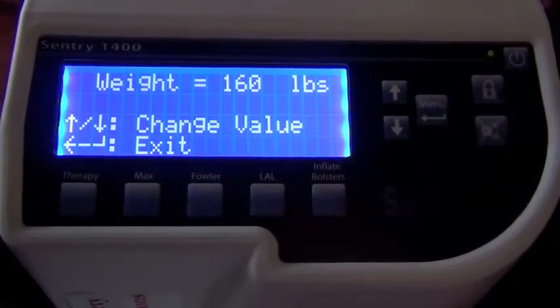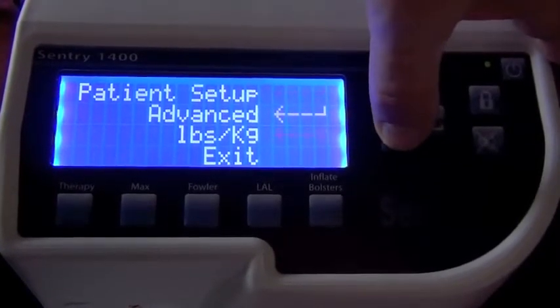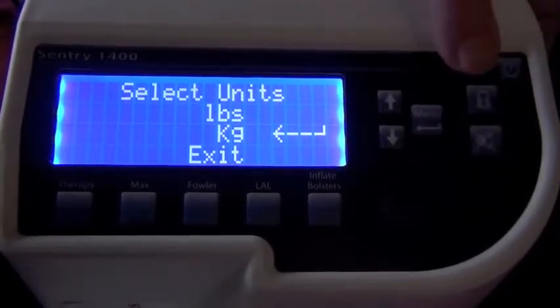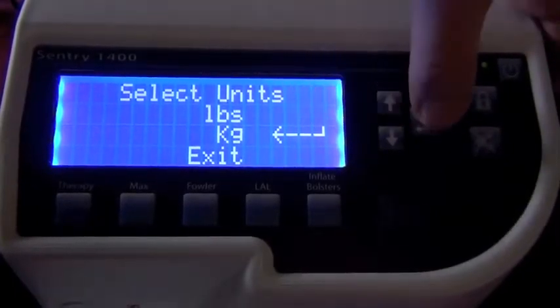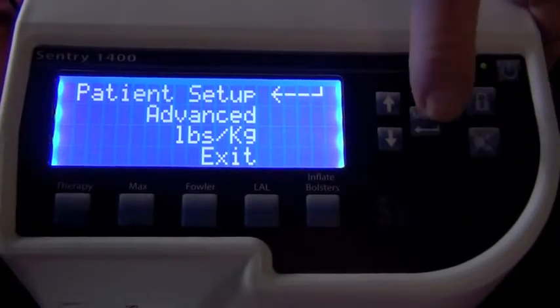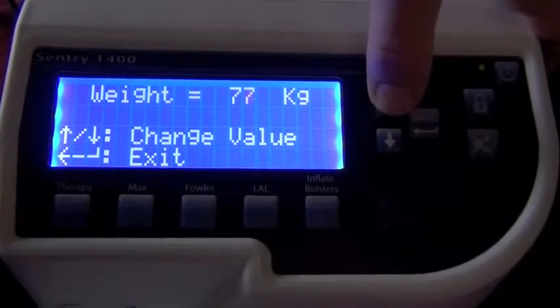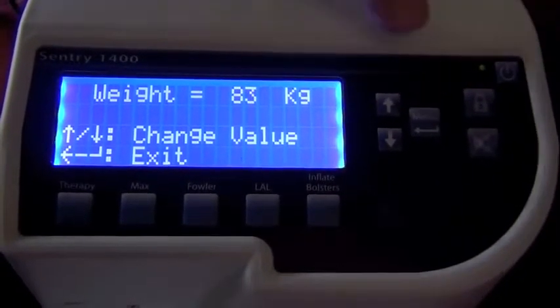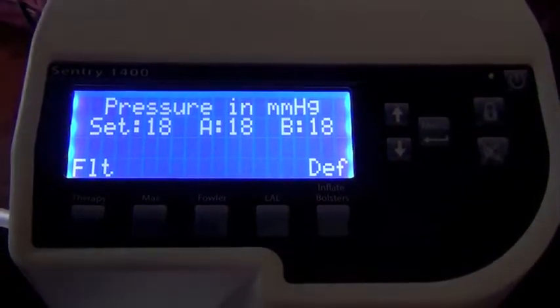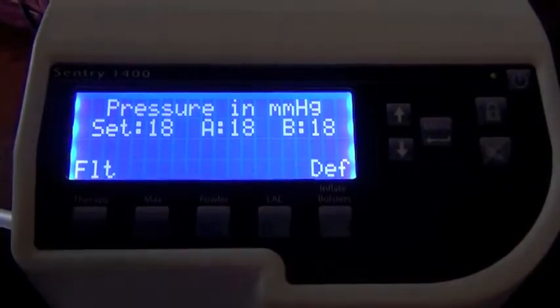And that again is on your main menu screen, and I'm going to go back there now just to show you that. If we toggle down to pounds and kilograms, now we have the ability to make that selection. So if you're using kilograms in your facility, you would select kilograms and then hit the menu button again, and now we're ready to do patient setup and to enter the patient's weight in kilograms. For this patient, we're going to assume they weigh 83 kilograms. Once we've entered that weight, we press the menu button again, and now the device knows that we are going to be using it for a patient that weighs 83 kilograms.